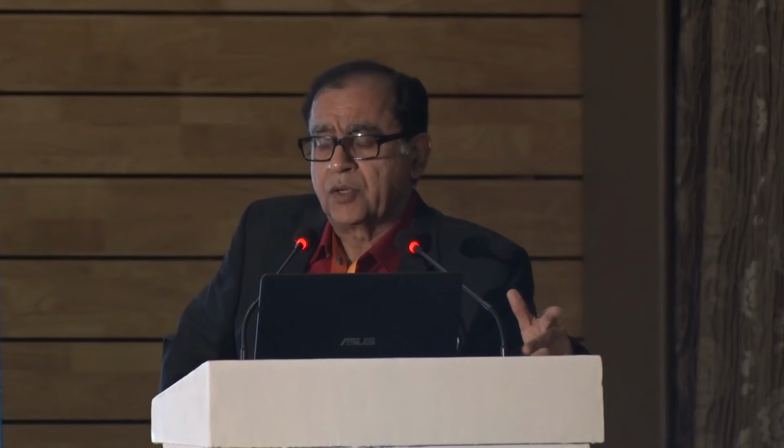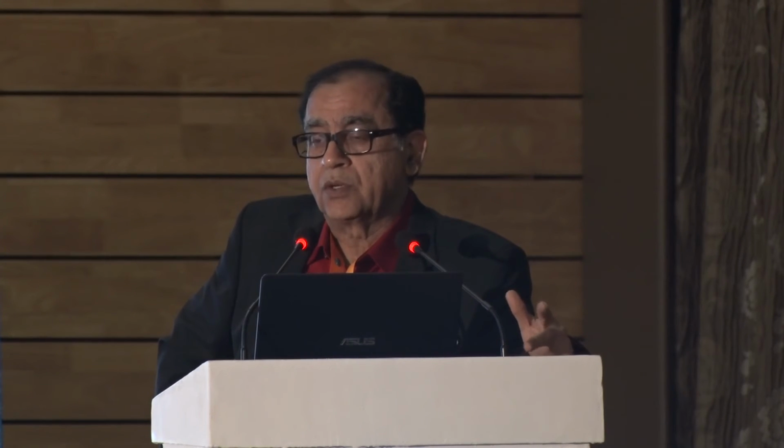Because whatever the xylocaine, bupivacaine, and the toxins are there, they cause too much damage to the intraocular tissues, and you cannot retrieve those eyes. Immediate vitrectomy is the only answer. And so this was removed from here.